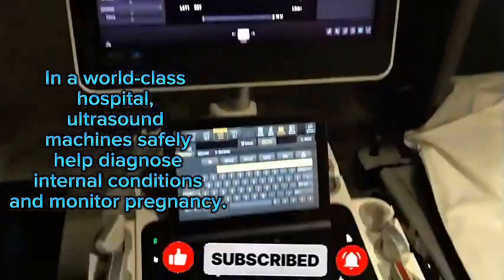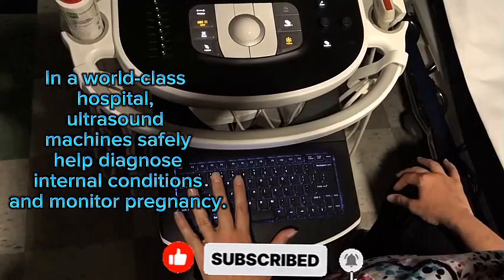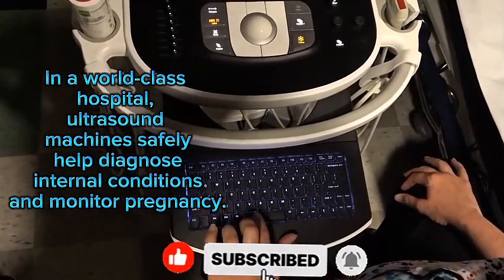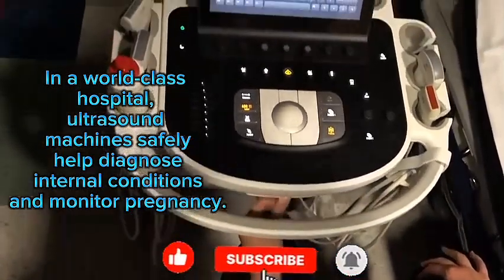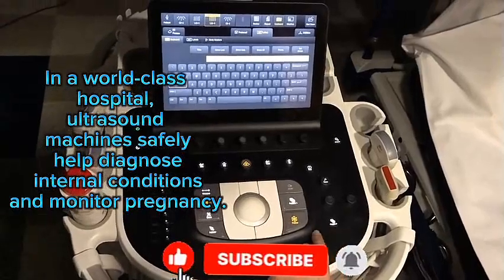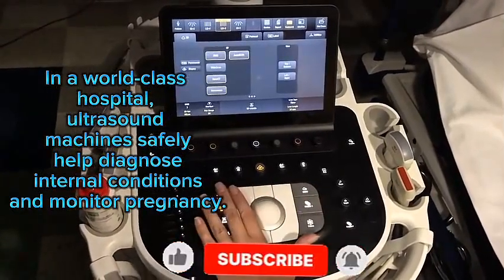But without hitting the space bar, it will not accept your typing. The space bar is what tells the machine that you're going to be using this keyboard. Once you're done, again, acquire your image. And then unfreeze to continue scanning.